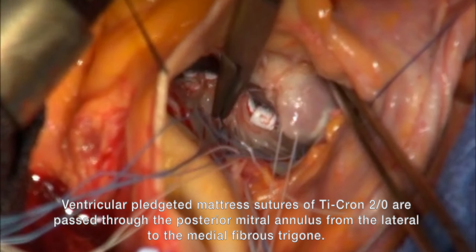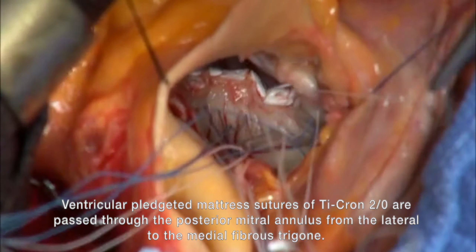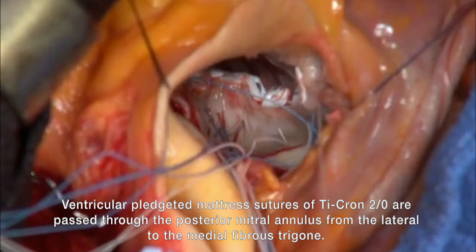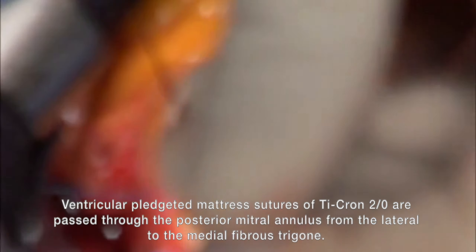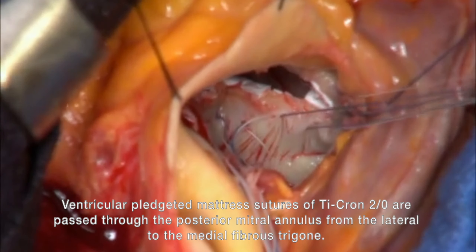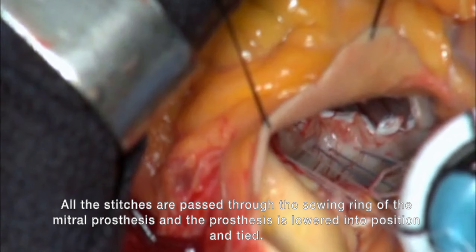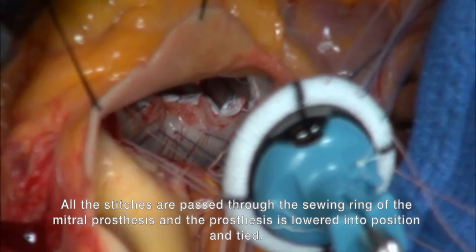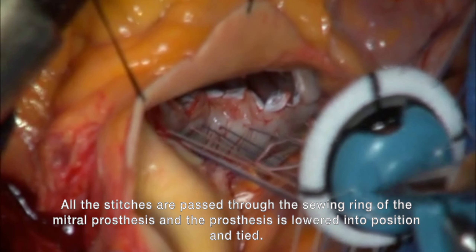Ventricular pledgeted mattress sutures of Ticron 2-0 are passed through the posterior mitral annulus from the lateral to the medial fibrous trigon. All the stitches are passed through the sewing ring of the mitral prosthesis, which is then lowered into position and tied.